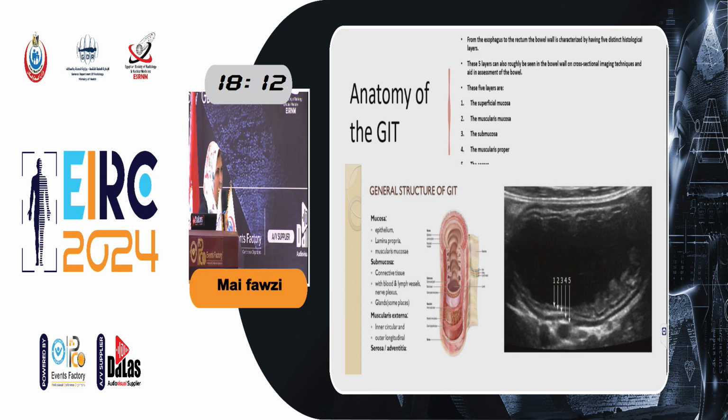What is the important part? I have to know histology in order to understand the ultrasound I'm going to see. We identify a bowel segment by its layers. First layer is the interface, the black layer is the mucosa, the white layer is the submucosa, the black layer is the muscularis propria, the last layer is the serosa. So, I have to identify bowel by finding 5 layers: black, white, black, white, and so on. I should not be saying this, I should be saying hypoechoic and hyperechoic, but this is easier to understand.